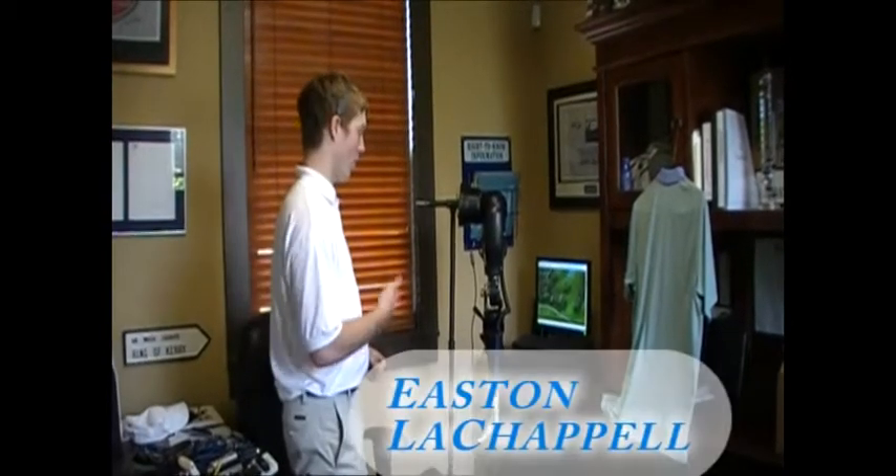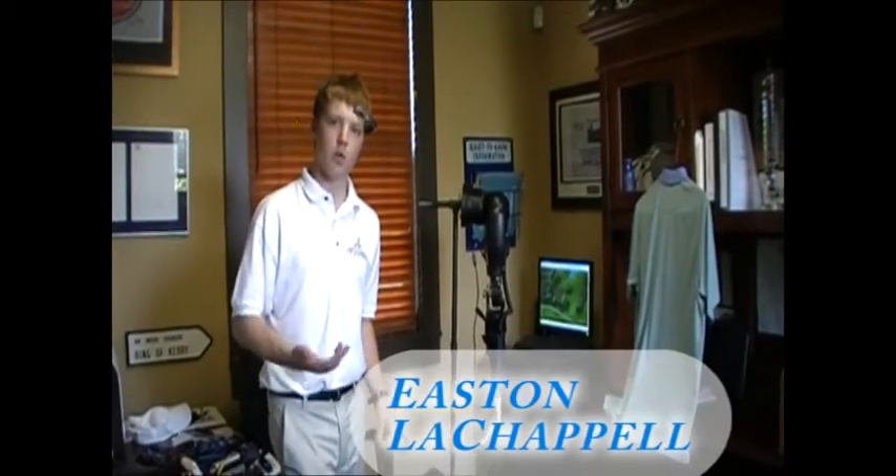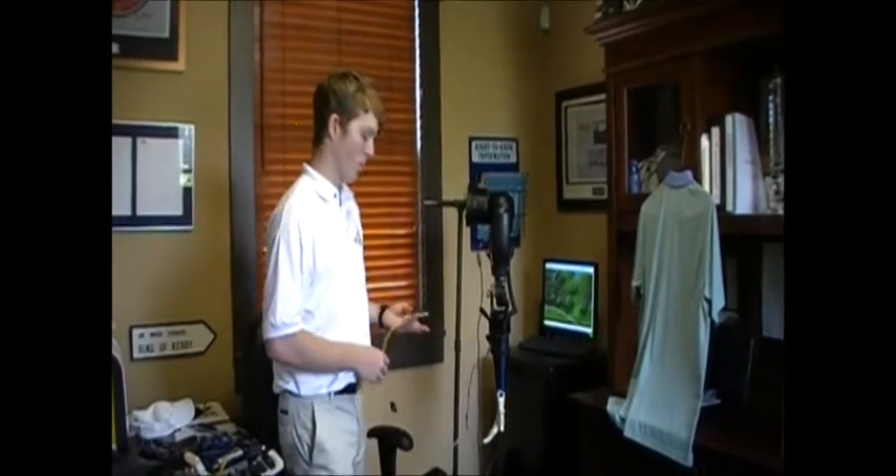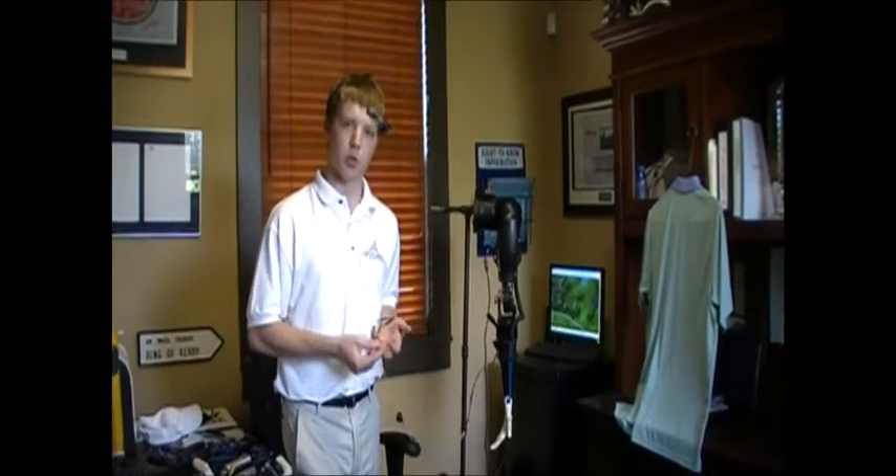This is just a quick demo of what the arm is capable of. My goal was to make it interactive with other users. This sensor replicates an EMG sensor, or a muscle contraction sensor. I put a force sensor on it so when I apply force to it, it will replicate muscle contractions.